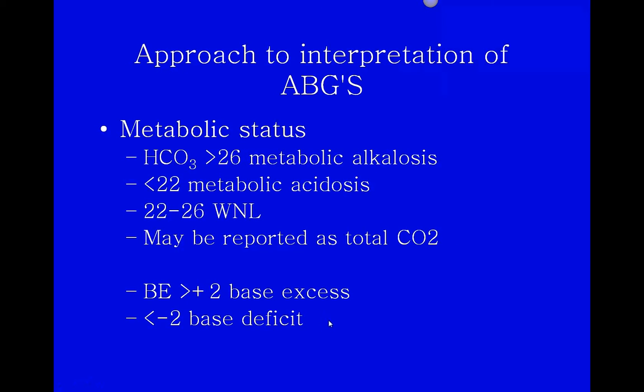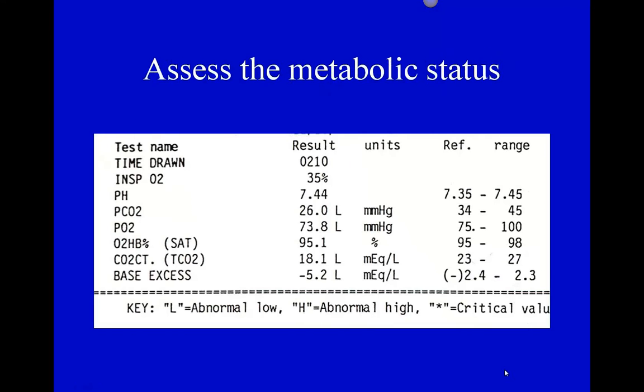And then base excess and base deficit, looked at that, whether I have extra bicarb or too little bicarb, so it's another way to look at that relationship between blood pH and whether I have extra or too little bicarb.